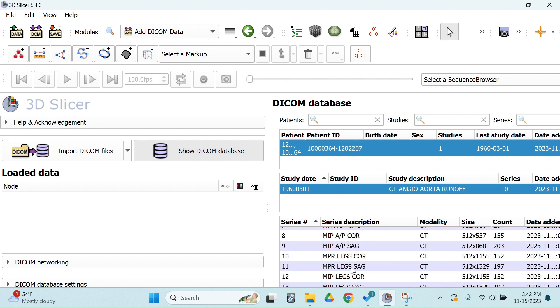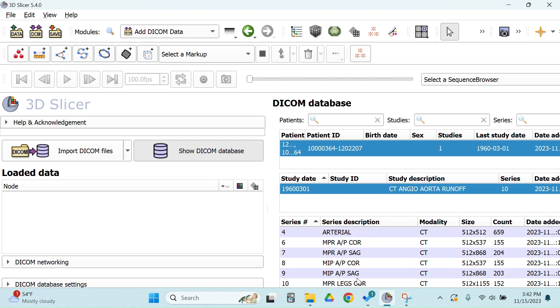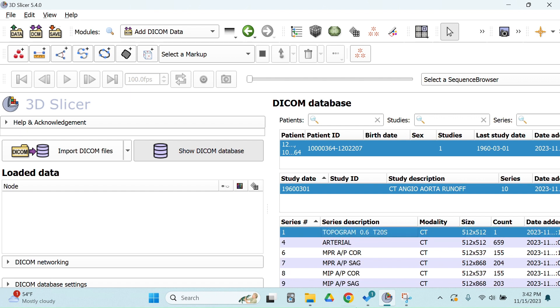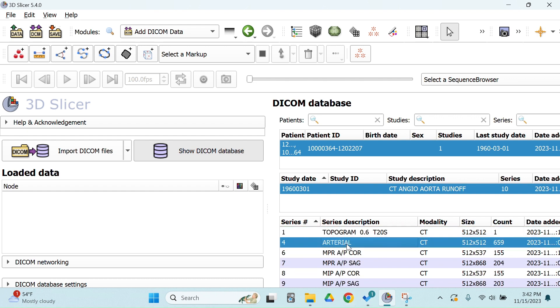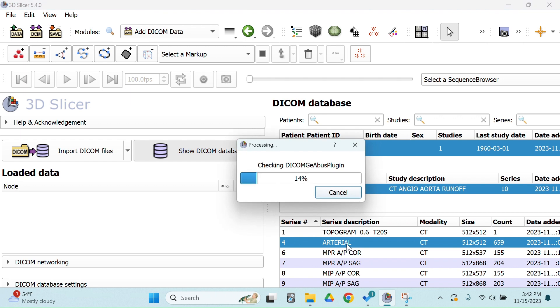So sometimes, especially when they have vague file names like this, you just have to look and see what you have. So let's start by opening the arterial series.